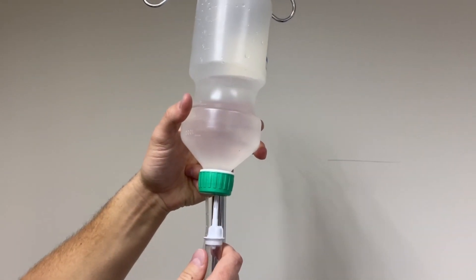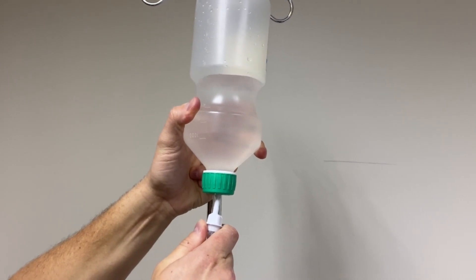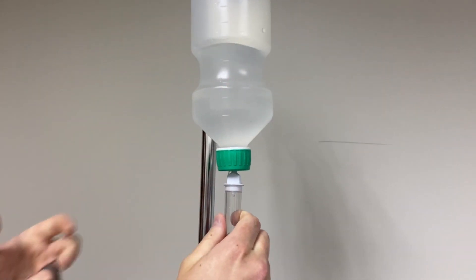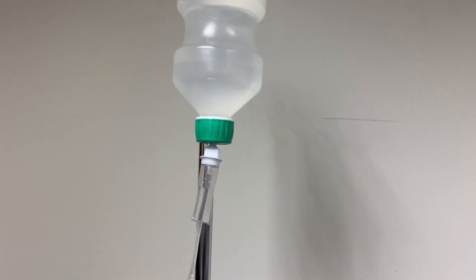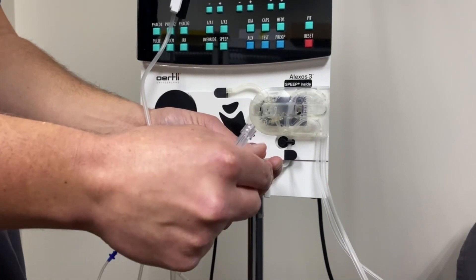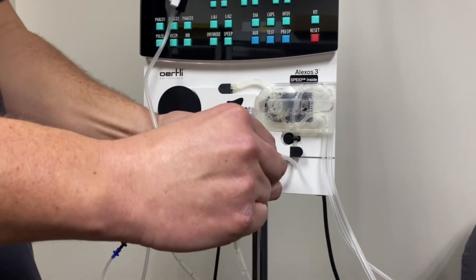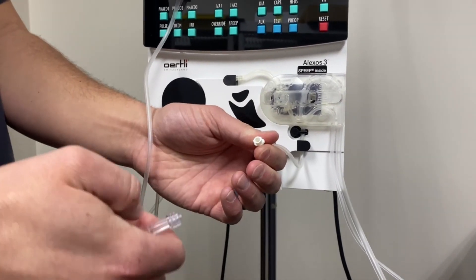Connect the giving set to the BSS bottle or bag. Fill the chamber halfway with BSS by squeezing. Remove the protection caps from the cassette infusion port and giving set. Connect the giving set to the infusion port of the Alaxos cassette.